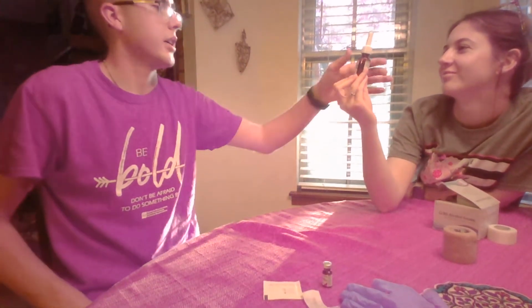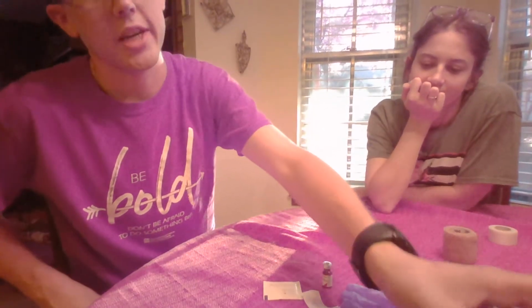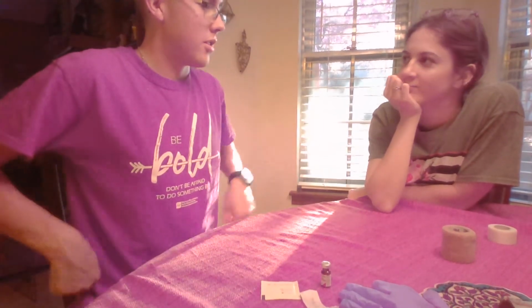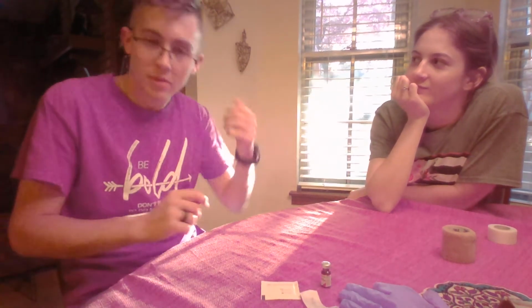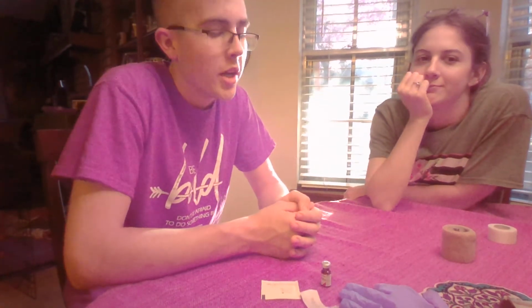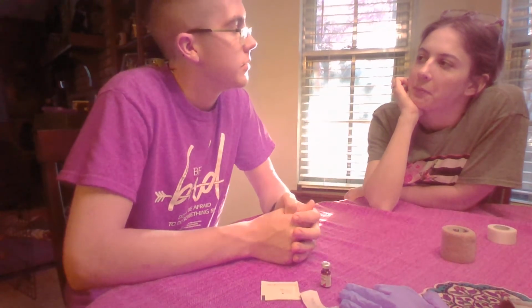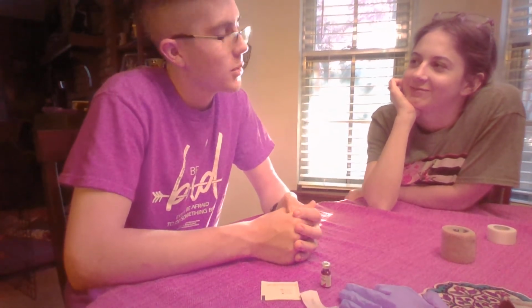Alrighty, this is my official attempt at providing an intranasal medication. Okay, so to start off, I'll be gathering up all my materials, make sure that my patient is being ventilated adequately. She's breathing on her own, so I don't need to be doing anything with that. Next, I'll be making sure whether they have any type of allergies. So, do you have any allergies to medications? Nope. Cool. After discovering that information, I will ask her, can you tell me your name and your date of birth? 12/13/99. Cool.